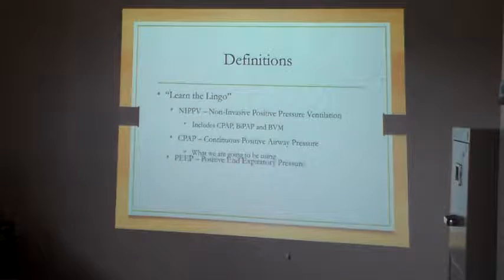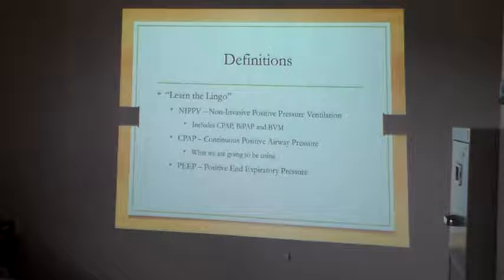Then we have something that goes with that called PEEP. And I'll show you a video, it's pretty cool here in just a minute. PEEP is positive end expiratory pressure, okay? This can be used on patients that are on a ventilator that's intubated, and I need to add this to this slide, it also is used with BVMs.